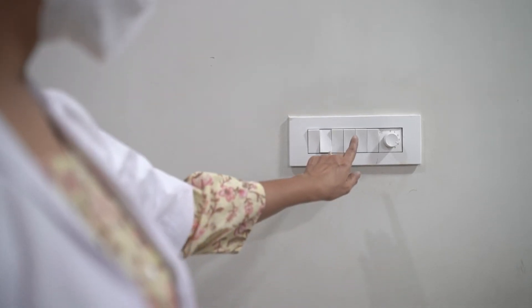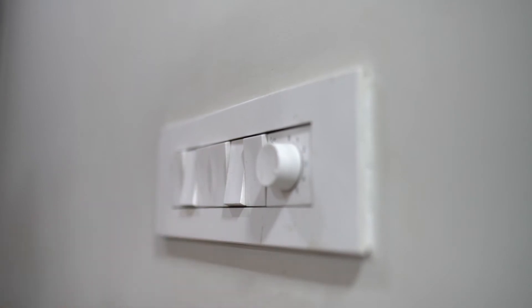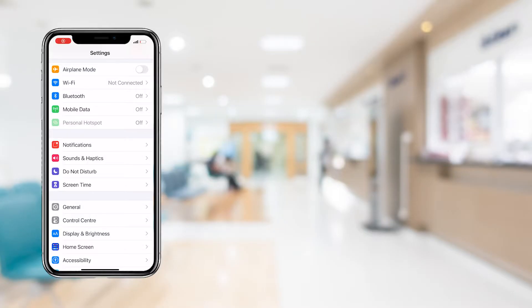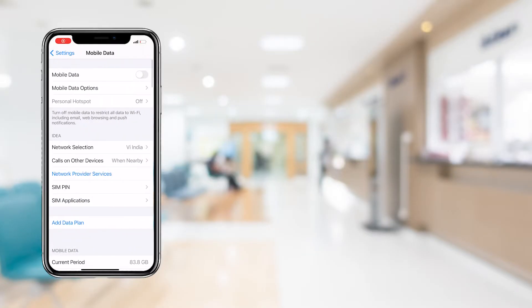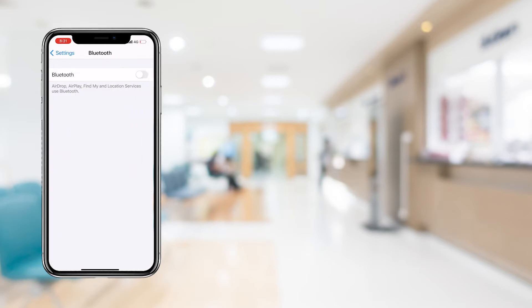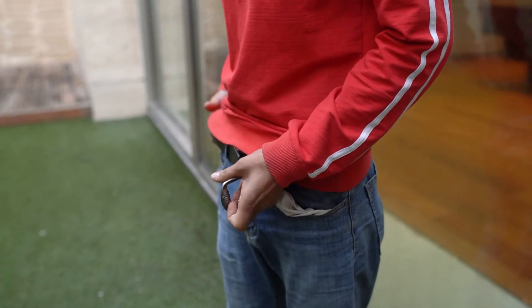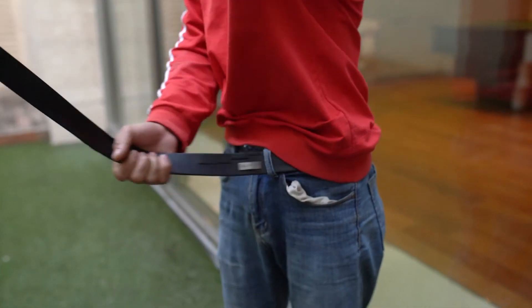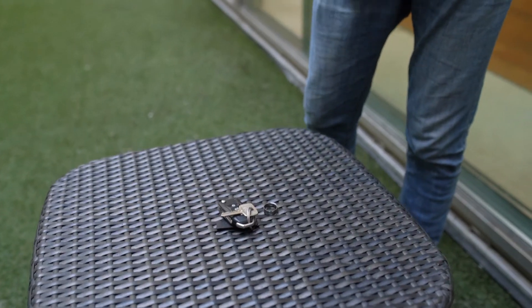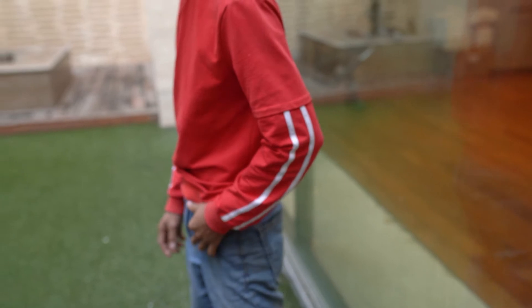Turn off all major appliances in the ECG room or choose a room with low electrical activity. Ensure that the phone you are using for capturing the ECG has an active internet connection and both its location services and Bluetooth are turned on. Request your patient to remove their top as well as any metallic items on their body, then ask them to lie comfortably on a flat surface. Please shave the patient's chest if necessary.